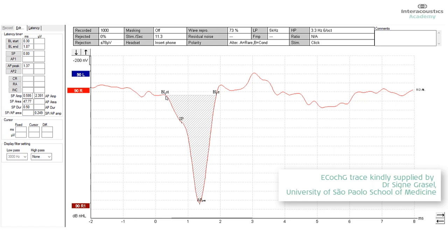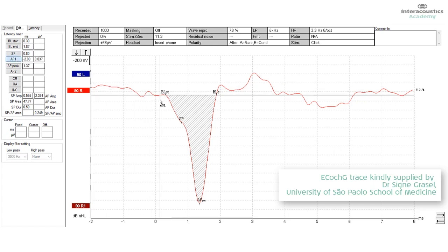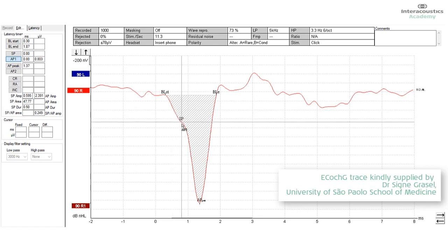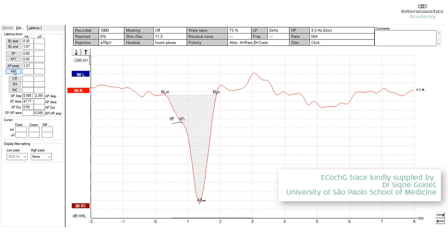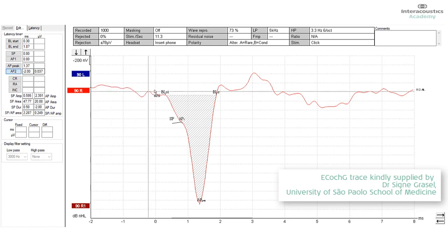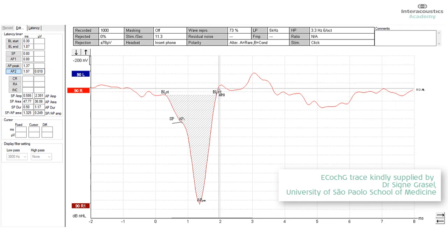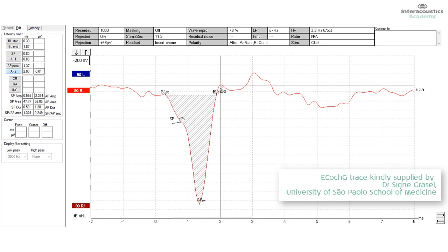And then we measure the AP area by taking that point where the AP begins, AP N1 will begin, and then connecting that to a point where the first positive peak of the AP is, and that's called AP 2. And so we tap off that portion of the response that we consider just the N1 component of the response.